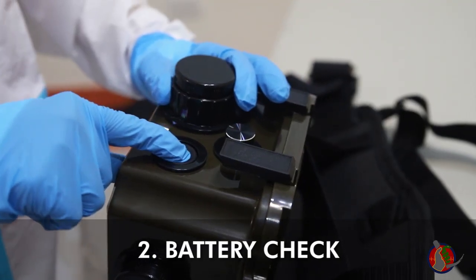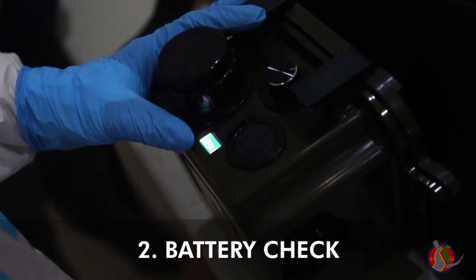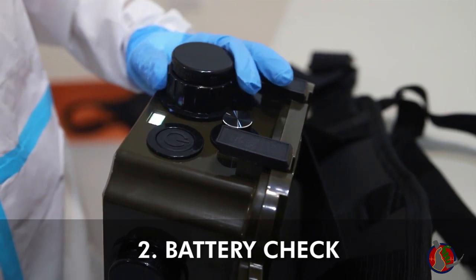Press the power button for one second to check battery power. Charge if less than 40%. Press for more than three seconds to turn on.